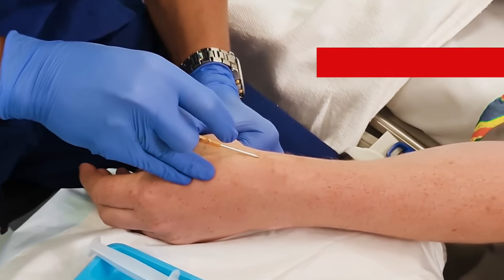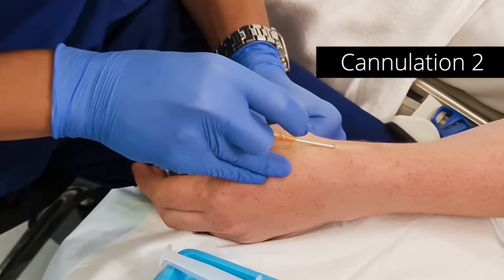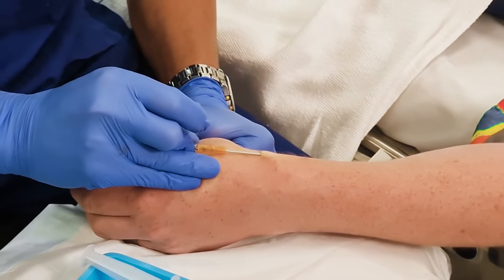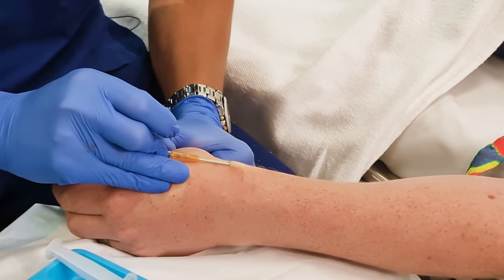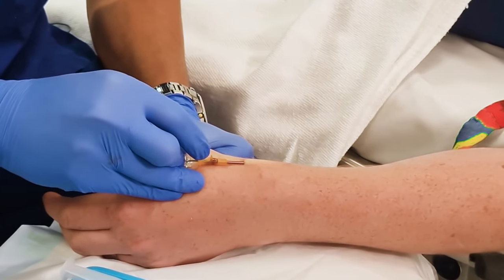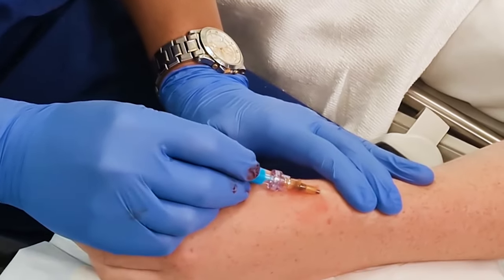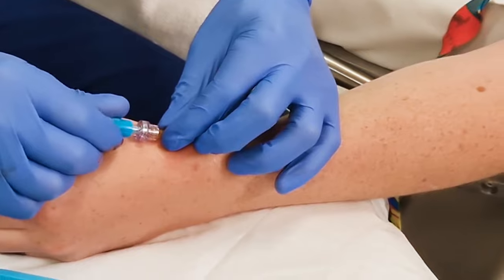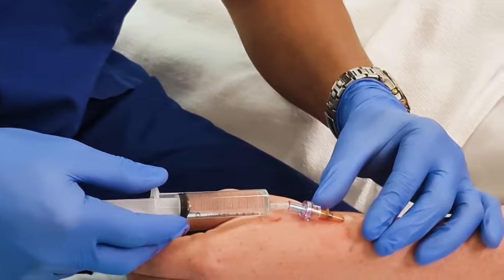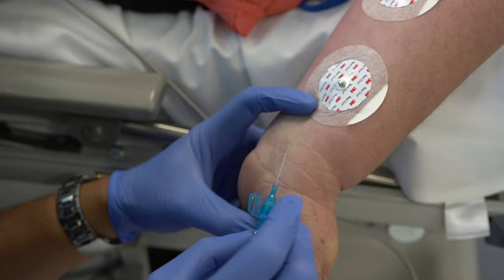This cannula is from an older video — it's a 14 gauge on my superstar friend Julian. As you can see, I'm going at a really low angle, going slowly. I observe the flashback, then I really level out and you can see the upward trajectory of the cannula. I go at least a centimeter of advancement before threading the cannula. You can see the secondary flashback there. I put lots of fingers over the proximal part of the cannula just to make sure there's no blood flowing back, and then I screw on the IV bung. Generally, you want to flush all these cannulas — in many of these videos I'm not showing the flushing because I administered medications very soon after.